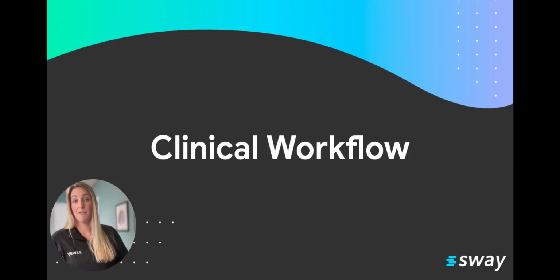So next, which is really the most important piece in a busy clinic, especially if it's outpatient, I've been there. Technology is great, but if it doesn't fit into your workflow, it's just not going to happen. So we'll talk about some ways that Sway has been successful in clinics and what works best for folks.